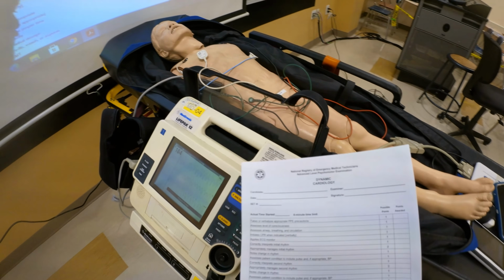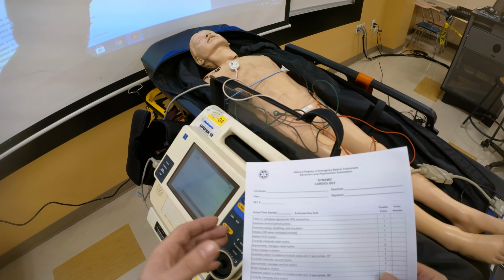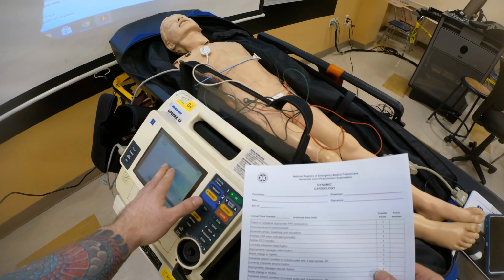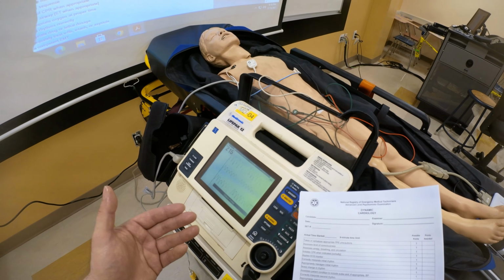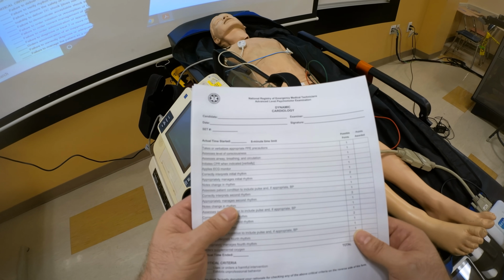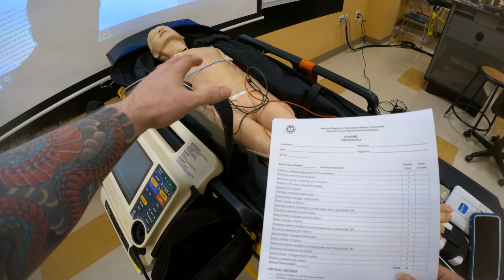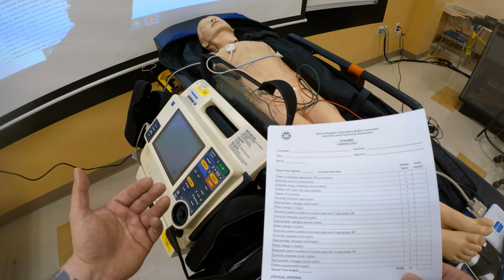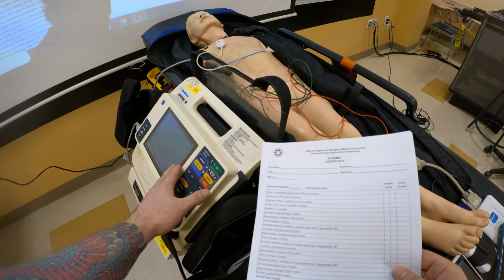Once you have connected your mannequin, and I have a separate video, which I'll link to, on how to connect all this so it's functional, and you've tested it and confirmed it is in working order, and you yourself perform all the electrical therapies as I show in the equipment setup, then you can begin, right? So get your skill sheets. You need to explain to the students that they are going to be verbalizing the treatments. However, electrical therapy and placement of the limb leads and the pads, they need to perform, and you need to be able to see that. You need to see how they're actually performing these energies.